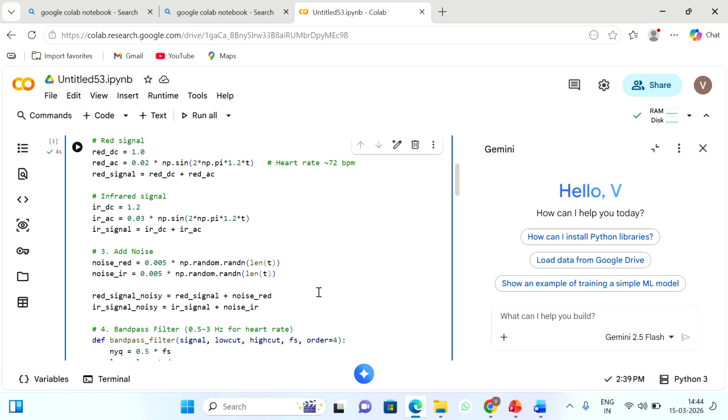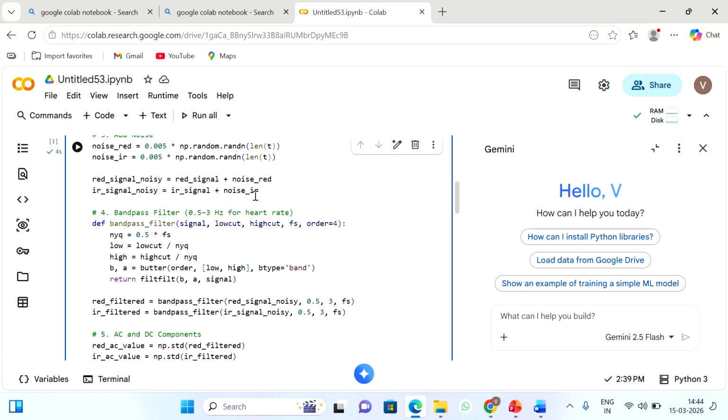Now the signals look more realistic. Then we apply a band pass filter, which is 0.5 to 3 hertz for heart rate. So here we define the band pass filter with signal, low cut, high cut, Fs, and order 4. Nyquist is 0.5 times Fs. Low is equal to low cut by Nyquist. Here Nyquist frequency is equal to Fs by 2, which is equal to 50 hertz. Low cut is equal to low cut by Nyquist. Why are we doing division by Nyquist? It normalizes the cutoff frequencies. So b, a is equal to butter(order, [low, high], btype equal to band).